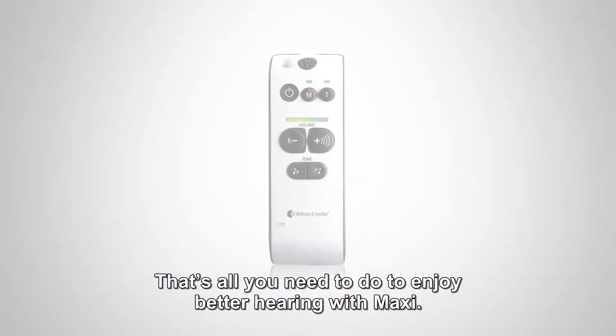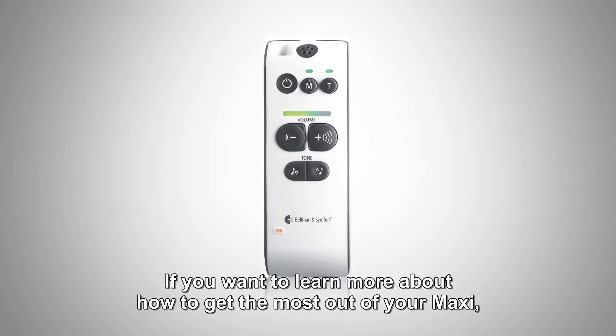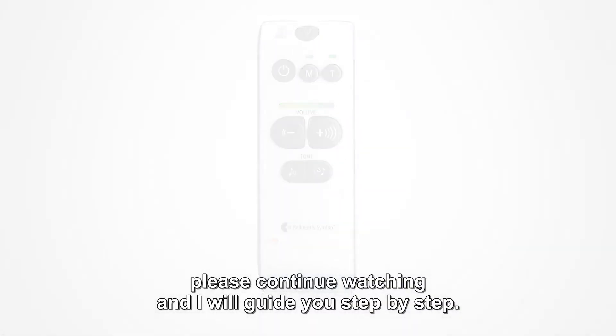That's all you need to do to enjoy better hearing with Maxi. If you want to learn more about how to get the most out of your Maxi, please continue watching and I will guide you step by step.